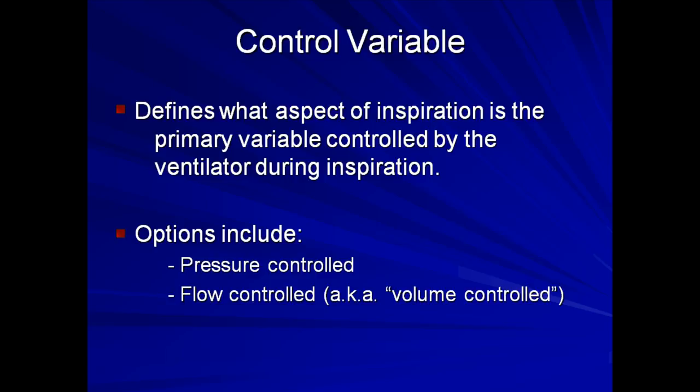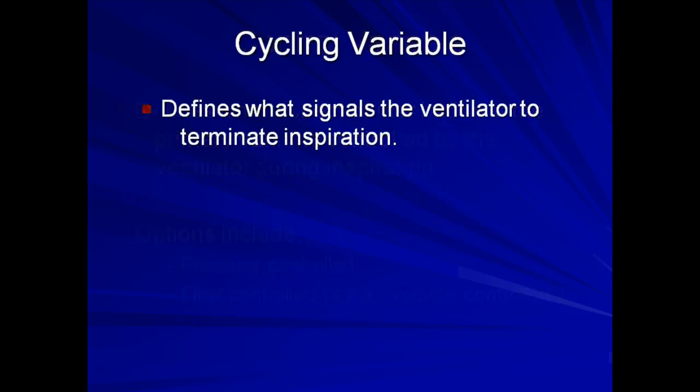Some people would therefore state that usage of the term volume control is technically erroneous, while others would brush off this criticism as inconsequential semantics. The cycling variable now defines what signals the ventilator to terminate inspiration.